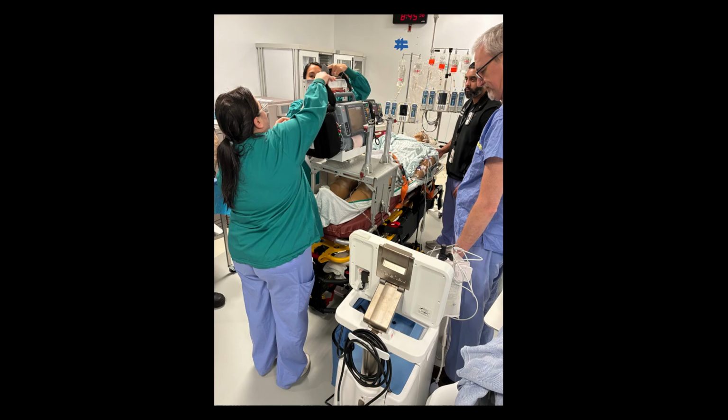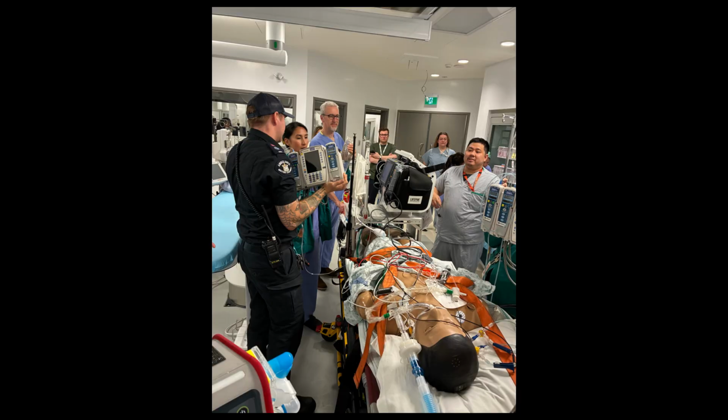Secure the defibrillator. Then secure the IV pumps. The pack rack can only fit maximum 2 pumps with 4 channels or 1 IV pump and 1 transport ventilator. Discuss these options with your RT.